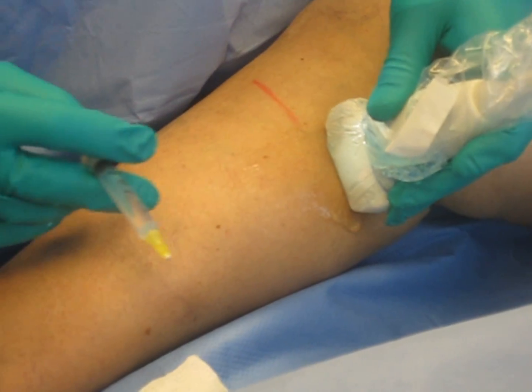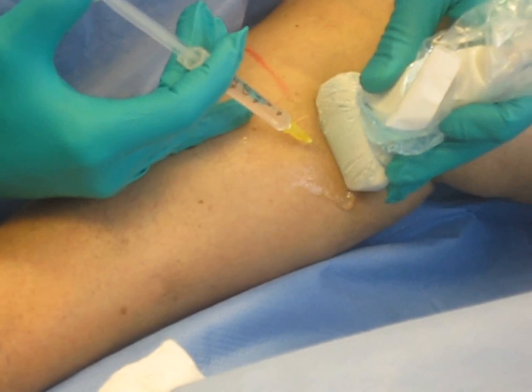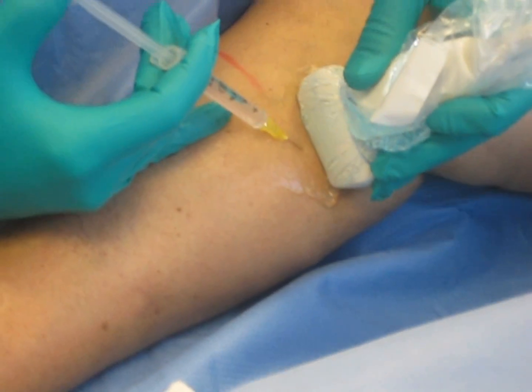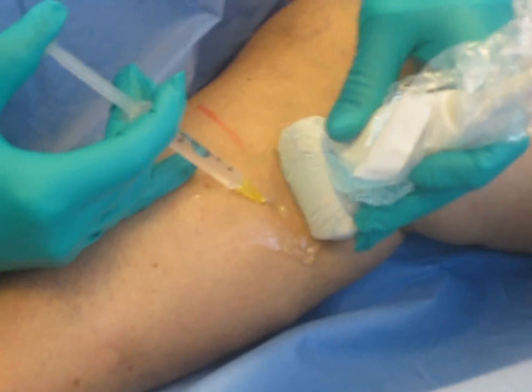This is to give you an idea from start to finish. We're going to numb her skin — just a little tiny numbing here. I should have warned her. We usually give every patient a little tiny heads up. Nancy's not helping me today.